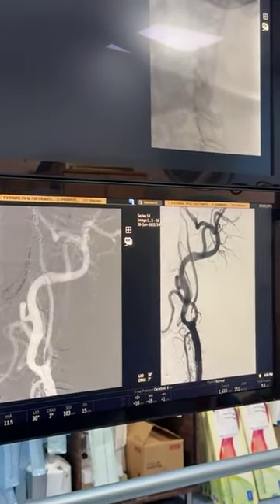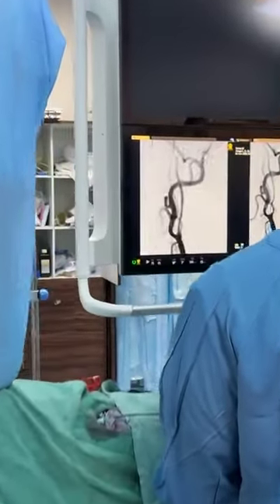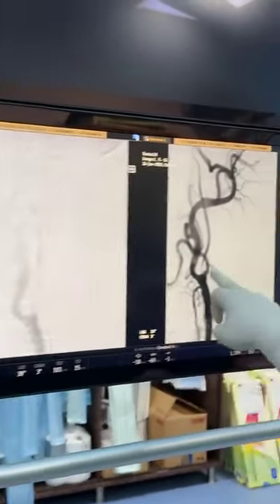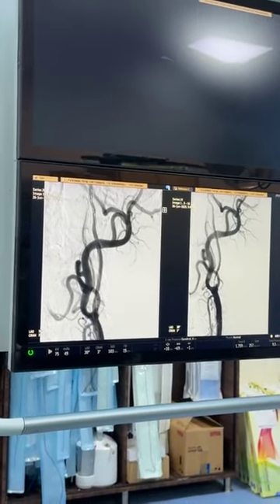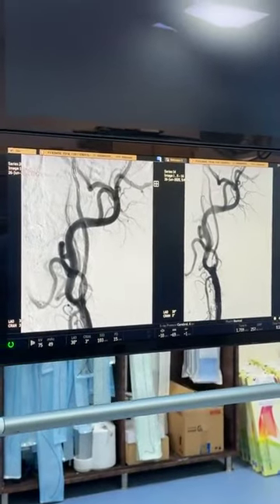So Dr. Sujit was there yesterday for the thoracoabdominal case. Dr. Sujit, what is your experience on carotid artery disease? You can see that it's a beautiful carotid artery. Here it is a critical stenosis. Now with the balloon angioplasty, you see that the blood flow has improved dramatically. We can put a stent and create a vessel which will be more permanent.